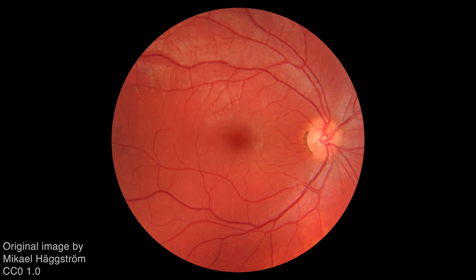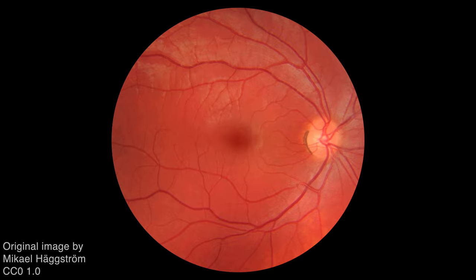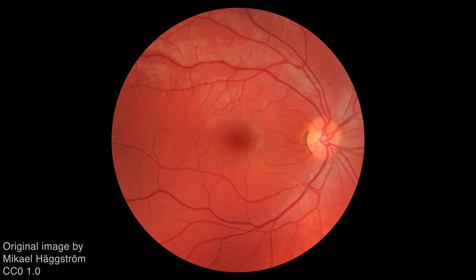Finally, regard the reddish background of the fundus. There aren't any exudates, hemorrhages, lesions, scars, or other signs of pathology.